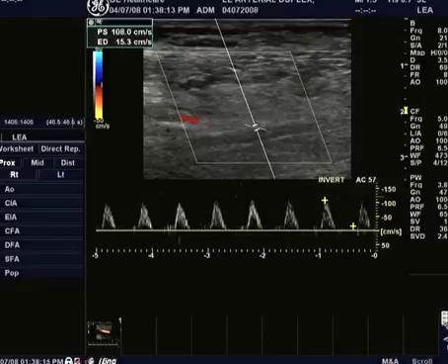Okay. And we see now, obviously, when I froze the image, I'm frozen at a different point, so we're not seeing the color. We would probably, before we capture this to send to our PACS or to give to our reading physician, scroll back and try to match up a decent color image with our Doppler. But for the demonstration today, I just want to show you our velocities.